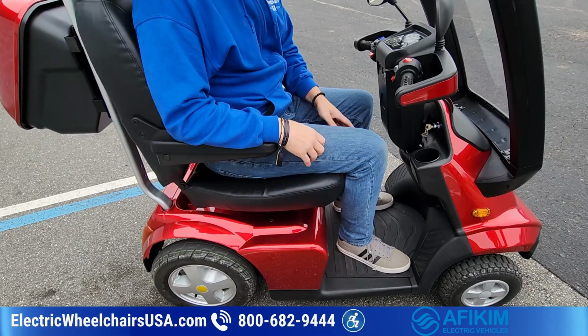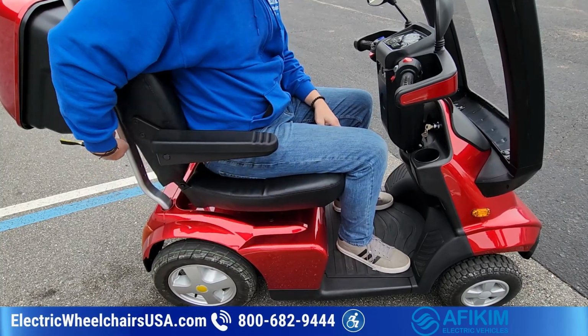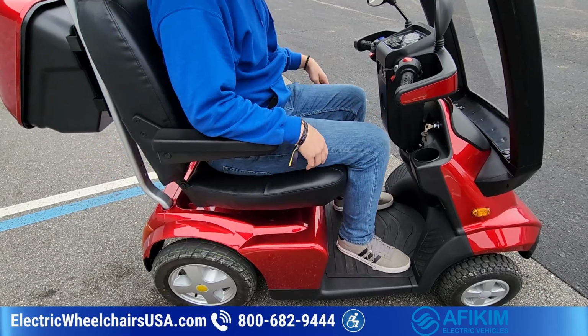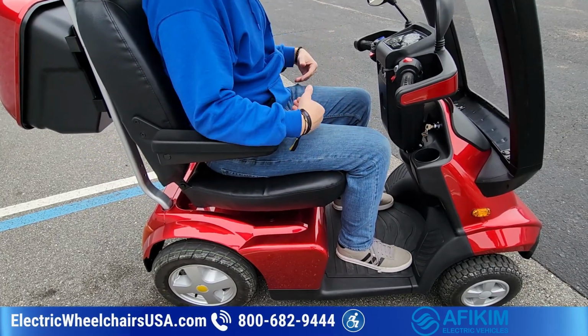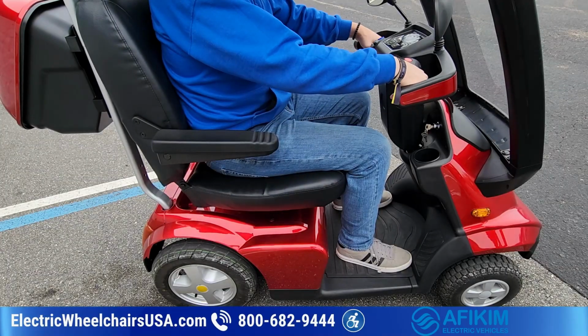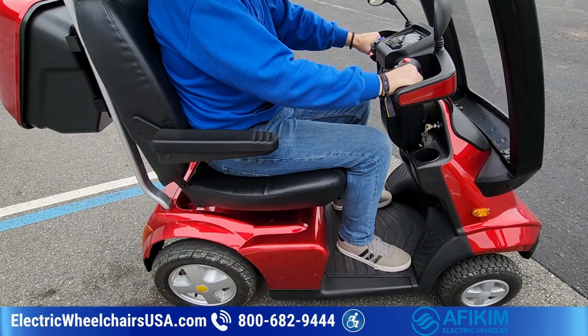You can see, actually, when I slide it back all the way against the back of these bars on the canopy, my knees don't hit, and I'm 6'4", so if you're shorter than me and you want the 24-inch wide seat, you'll probably be just fine, but I wouldn't be much taller than what I am.